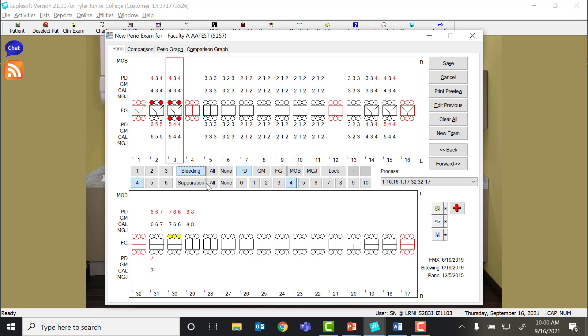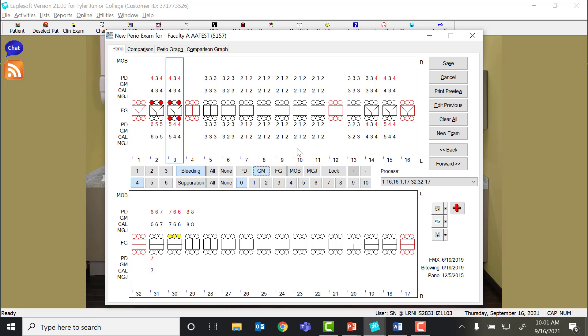After all the probe depths are done, you will want to go back and measure recession. I do not recommend doing the recession at the same time as probing, because it's very easy to forget to click back on the PD button, and then you will record all your actual probe depths as gingival margin. So it's just more efficient to do all the probe depth readings along with bleeding and suppuration all at the same time, and then go back and do the gingival margin.